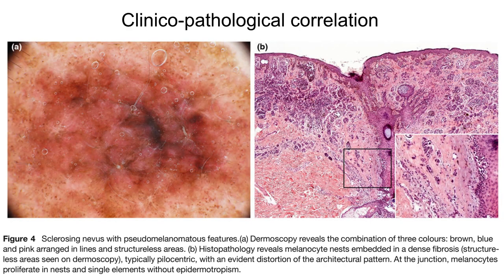Here is another example of a sclerosing nevus, in this case with predominance of structureless areas, blue and white, and the histopathological correspondence again showing junctional alteration atypia, the sclerosing band, and the dermal nest in depth.